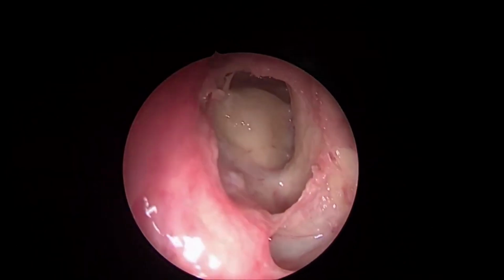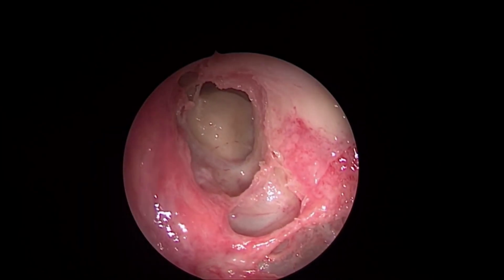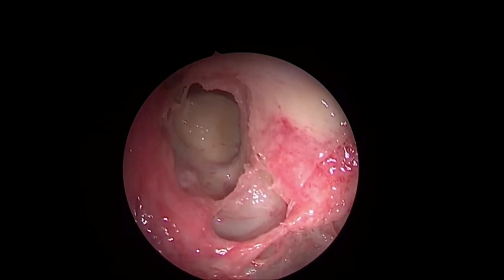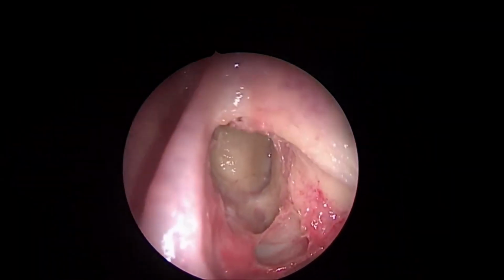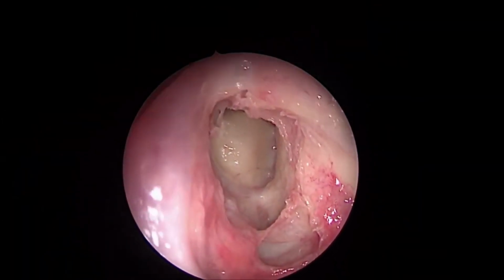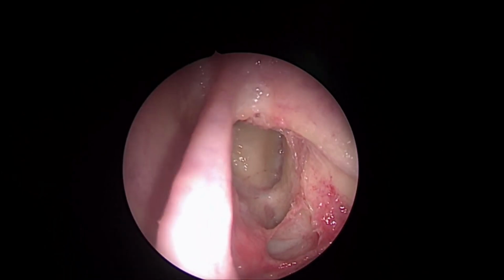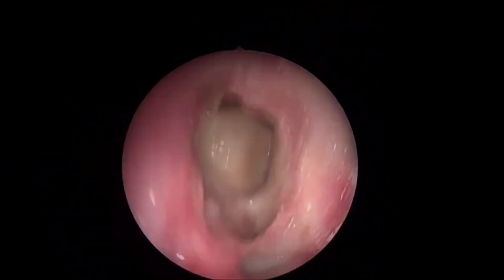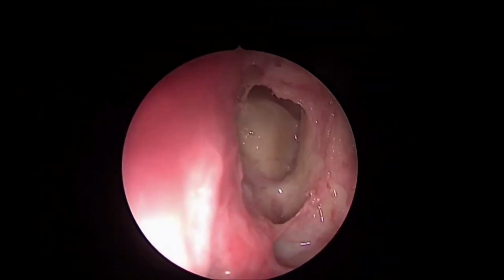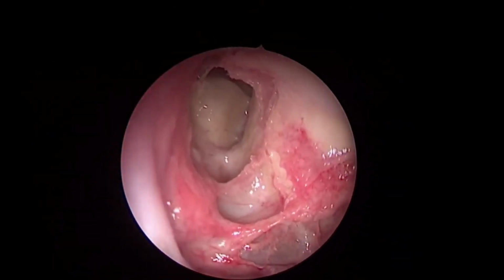When we discuss sinus surgery at any platform, most of the audience have some sort of fear or inhibition regarding frontal sinus work. The number one reason is the inability to use the 70-degree endoscope widely, and number two, the fear of complication. To shatter those fears, I am here today to apprise you of all those fine details by means of which you can carry out this work very safely. So this is about the frontal sinus in a regular sinus surgery.